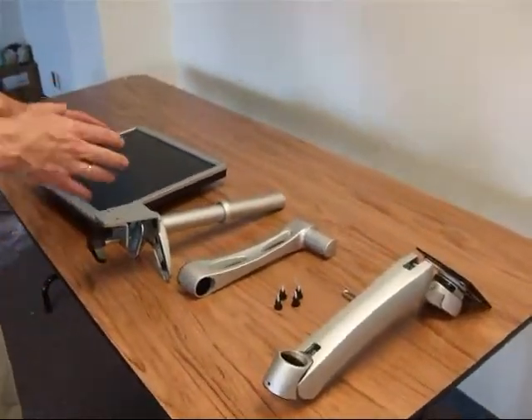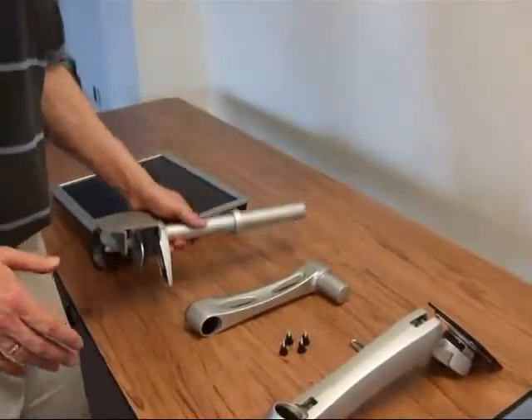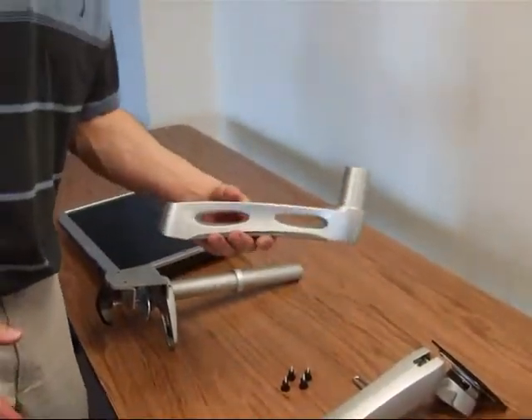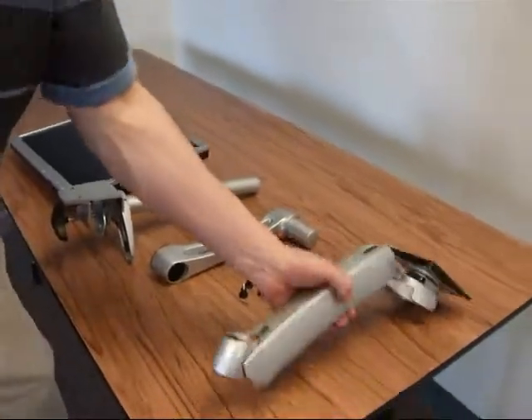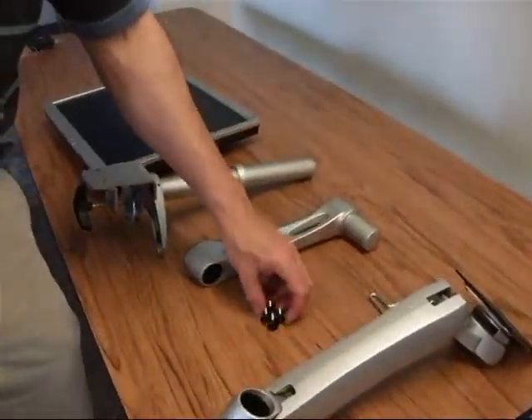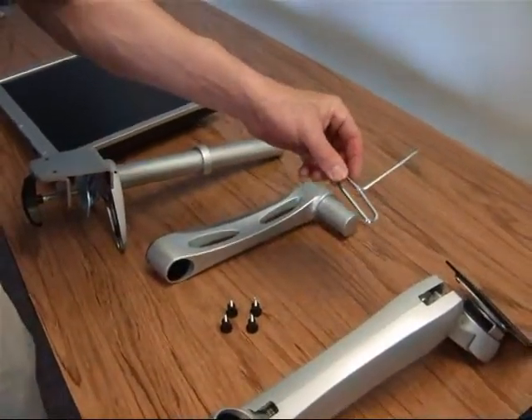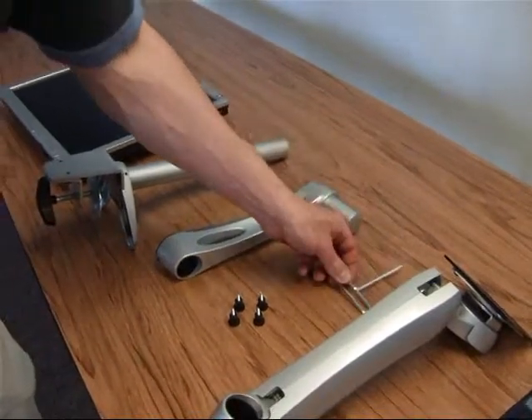Let's take a look at the parts and pieces that we have. We have the base clamp for the monitor arm, we have the middle piece for the monitor arm, and we have the front that actually holds the display. We have four thumb screws for the monitor, and we have one wrench to adjust the tension up and down.